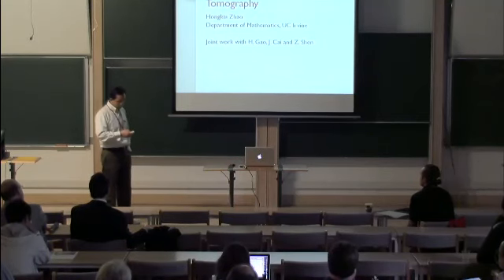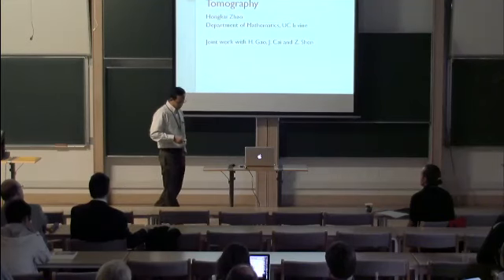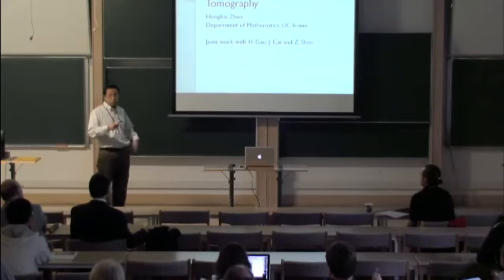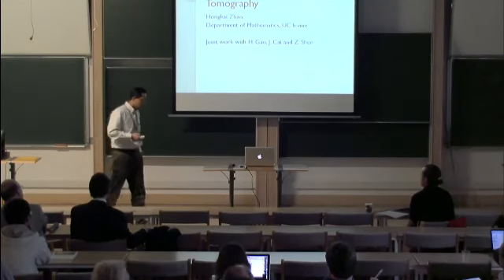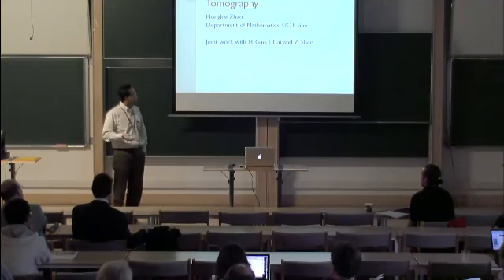So here we're trying to apply some recent developments in information science or image analysis to 4D computed tomography, especially to address the 4D, which means capturing the motion in order to get a treatment plan dynamically depending on time.